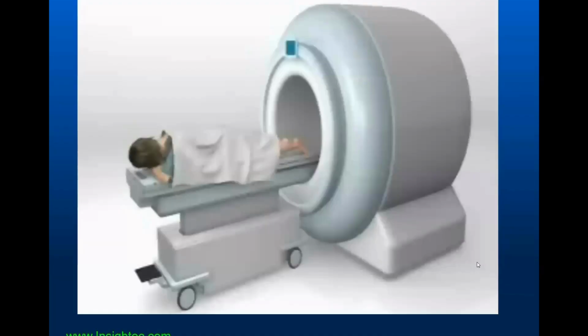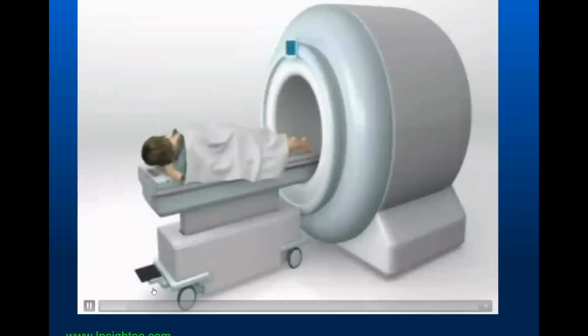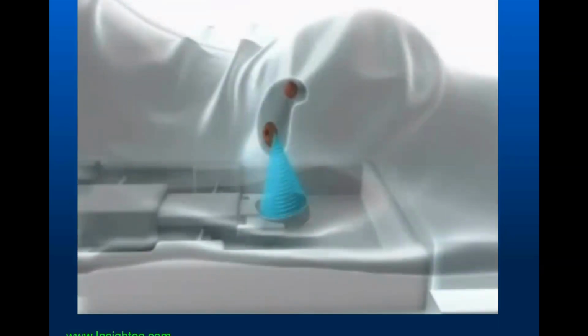So let's see how uterine fibroids, for example, we treated. This is very common to be done with MRI-guided HIFU. This definitely can be done with ultrasound-guided HIFU as well, but this is more common in the United States. So we basically put the patient in the scanner. We do the MRI, we see the fibroids, and now we start to do our sonications. So the probe will be moving to shoot at the tumor until we cover the whole tumor. And again, we keep repeating this. The good thing is the ultrasound really goes through the tissues, does not cause any harm before or after the focus, ideally. So this is basically the beauty of this kind of treatment.